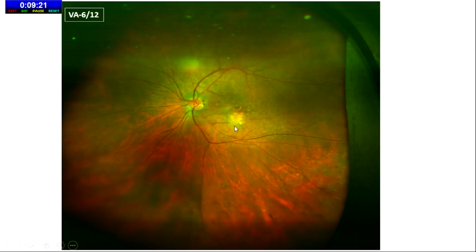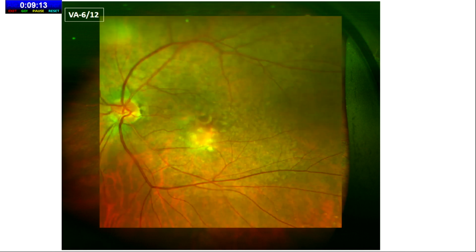That there is artifact, and you'll soon see why, because we have serial follow-up on that. So kindly ignore that. Had multiple drusen in this eye. That's the blown up of the same, and hence the artifact is also there. So multiple drusen, no hemorrhage, no fluid clinically. Patient was 6/12, had a very early immature senile cataract, and this is the best corrected vision.